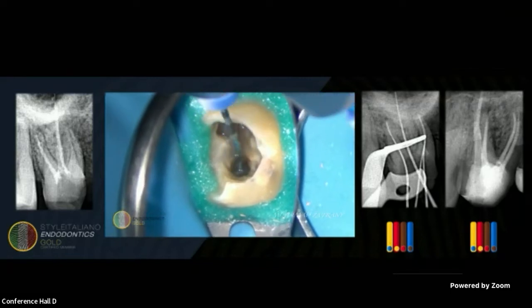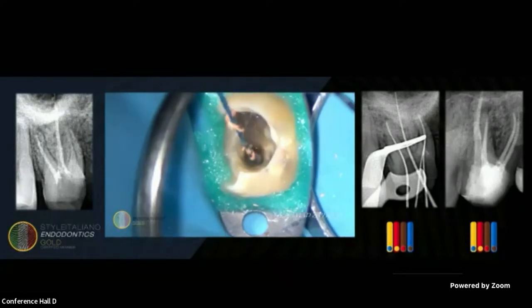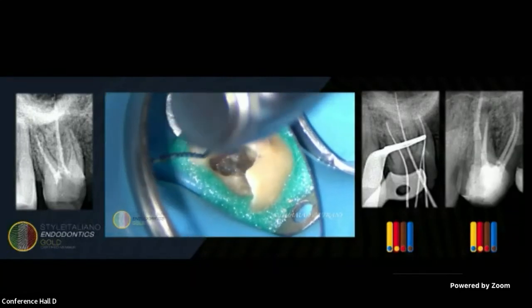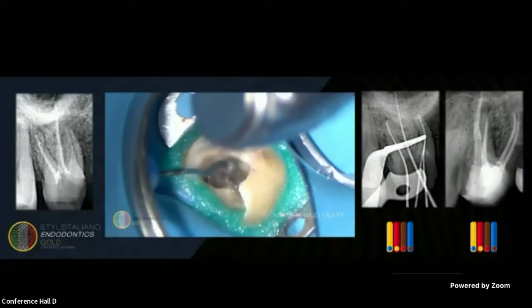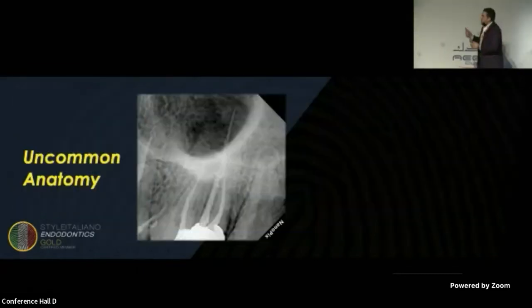These files are used at high speed, so they will expand. The apex of curvatures will expand, touching more canal anatomy. So this is my protocol for gutta-percha removal. Consider this a very important step during the treatment. It's not only reaching the working length, but you should remove all remnants of the old gutta-percha inside the root canal from your old treatment or previous treatment.